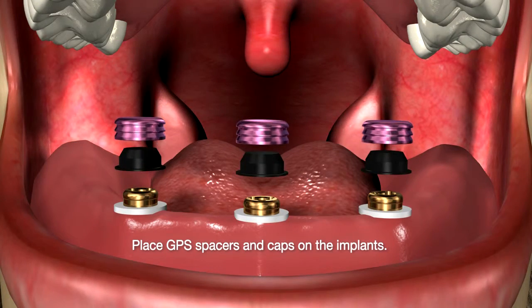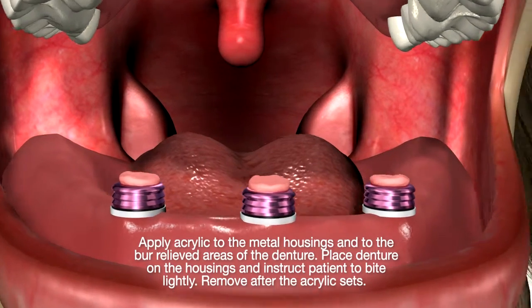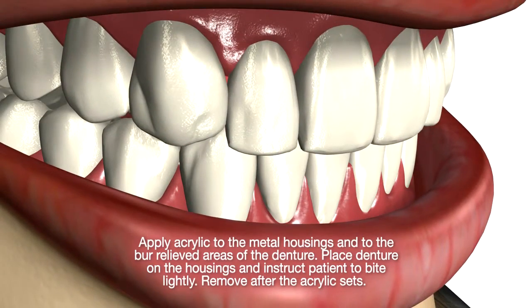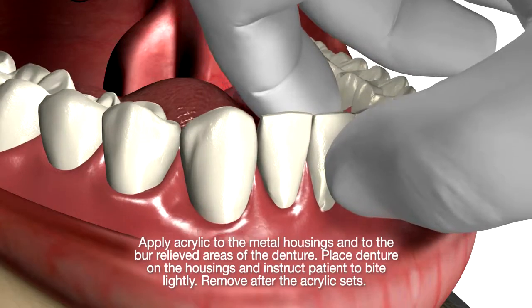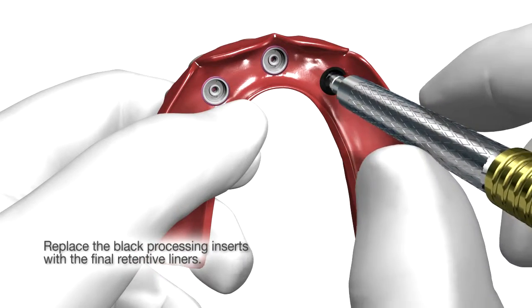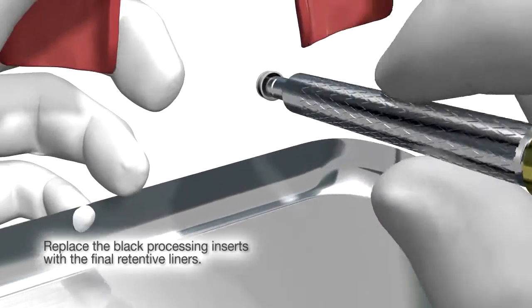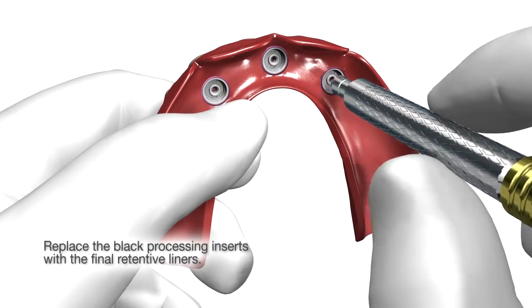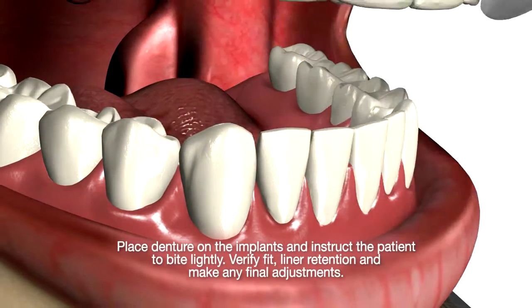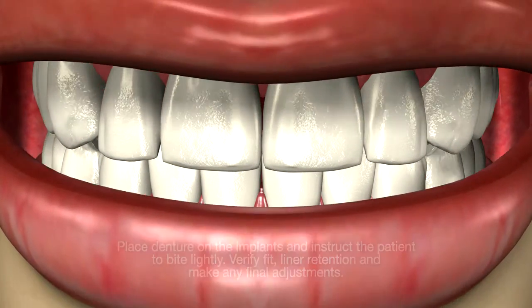Put some cold cure acrylic on the top, seat the denture, and allow it to cure. You then replace the black insert with the nylon one. There's a special tool for doing that. And that's how we do overdentures.